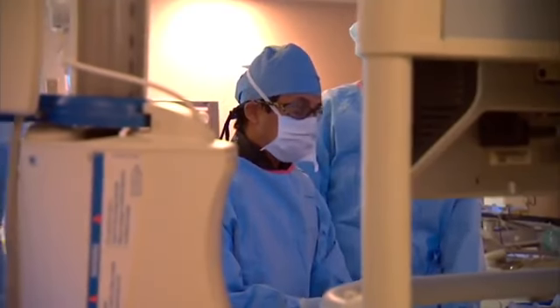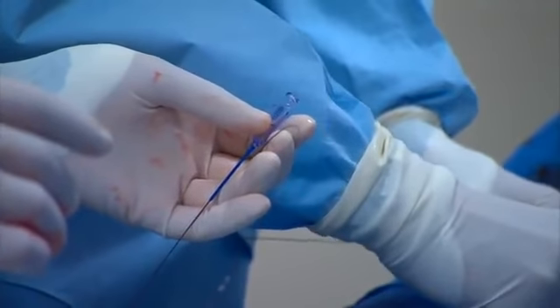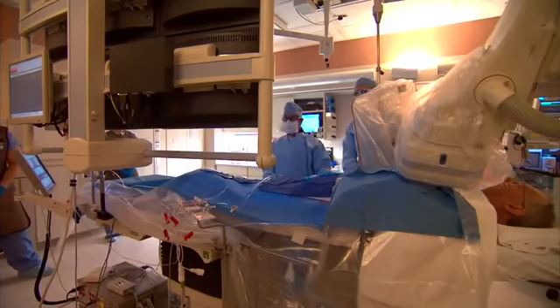Dr. Rajiv Gulati says most of those stents were placed the traditional way, via the femoral artery. The downside of that has been that patients will often need to lie flat for a number of hours after the procedure because there is a risk of the femoral artery bleeding because it's under high pressure. And we need to allow the vessel to heal up before we can have the patient move around. But Greg's last stent was placed using a different entry point, the radial artery in the wrist.